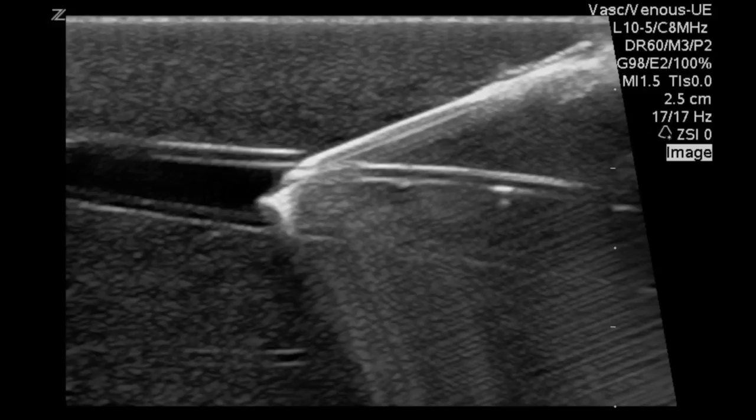And that's what we see here with the needle, where we see the echogenic bright needle within the vessel, but we see these repeating lines reverberating from that. And that's that ring down or reverberation artifact. And that's because the sound beams are bouncing around in the needle a little bit, so we're having the images of the wall repeated over and over again. This lets you visualize things like metal a little differently, so you can see that this is a foreign body and metallic in nature, such as your needle for procedural guidance.